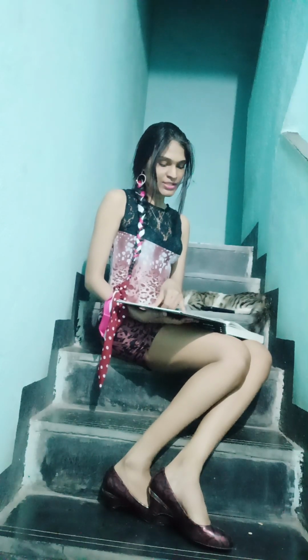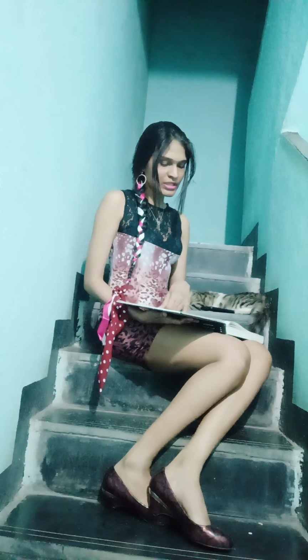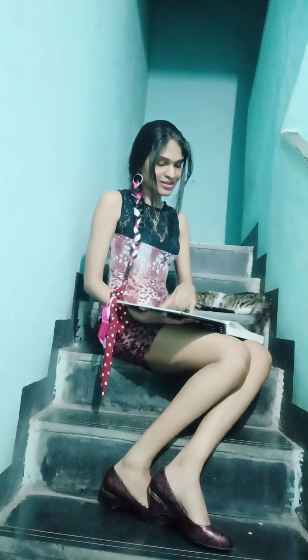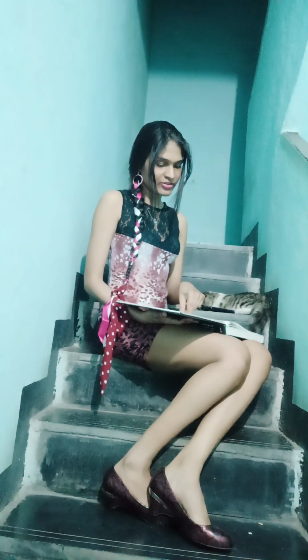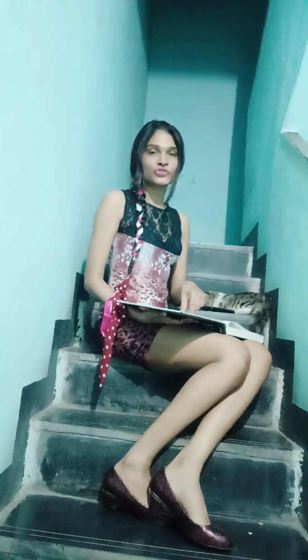Now in figure F you can see the principle of indirect gonioscopy. The contact lens that is used for indirect gonioscopy is called a gonioprism. Why? Because it has got 1 mirror, 2 mirrors, 3 mirrors or 4 mirrors. There are different types. Okay, so the light is coming from the anterior chamber angle. It is incident on the mirror here in the lens. Again the light rays are not refracted at the cornea and the posterior curvature of the contact lens because both have a similar refractive index.